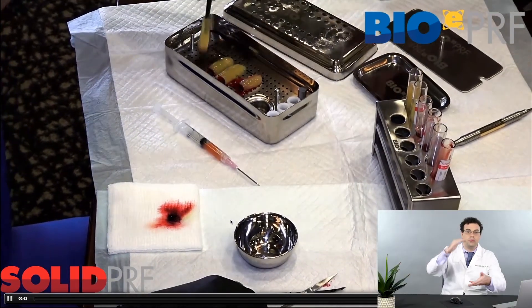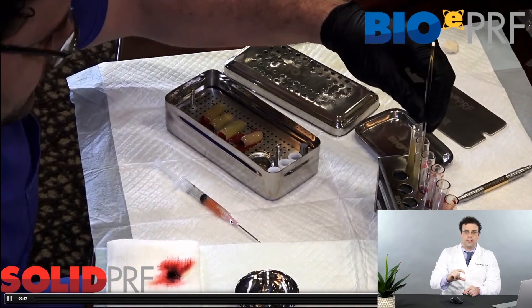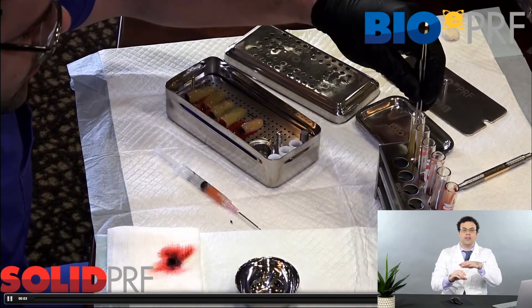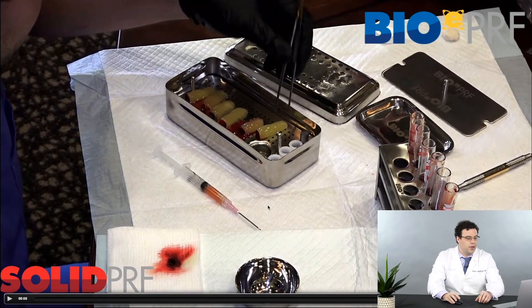One thing you definitely do not want to do with a full-size PRF membrane: always remember the majority of the cells are found at the bottom. Make sure you're not cutting the membrane a quarter of the way up into the plasma and removing all those cells, because that is the most concentrated area. That's the protocol to make a simple PRF clot.